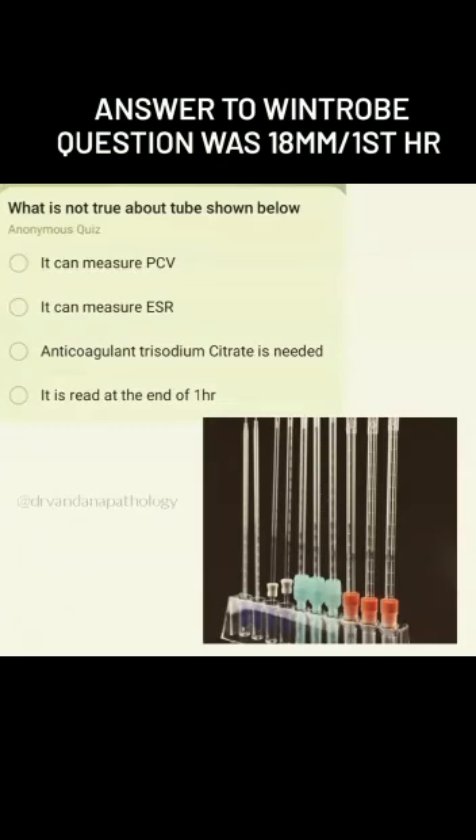Now in contrast, look at the second tube here. This is a Westergren pipette — it is open from both ends. It is 30 centimeters long, but the numbering goes only from 0 to 20 centimeters, and it is numbered from one end only. That is why it is used only to estimate ESR. The anticoagulant used for the Wintrobe tube is EDTA, and for the Westergren pipette it is 3.8% trisodium citrate. Look at this chart.